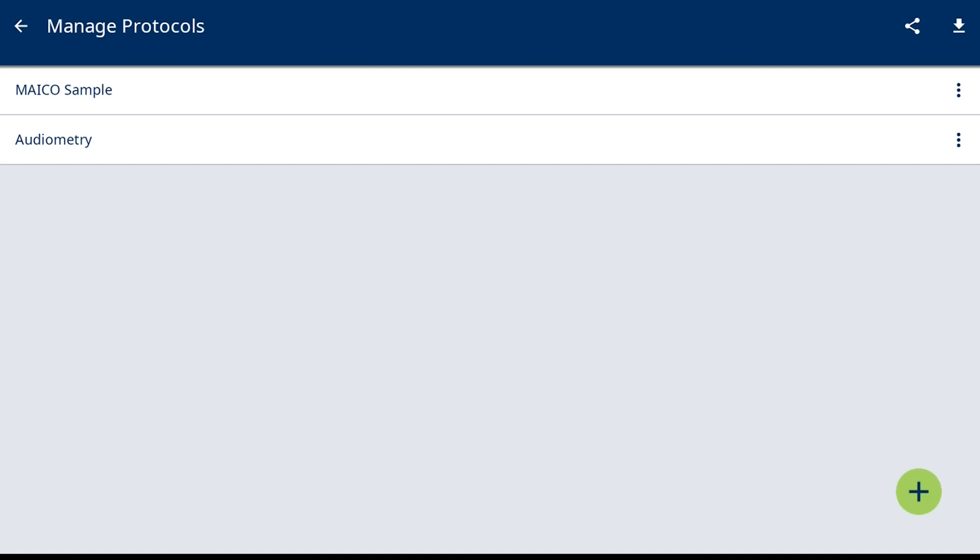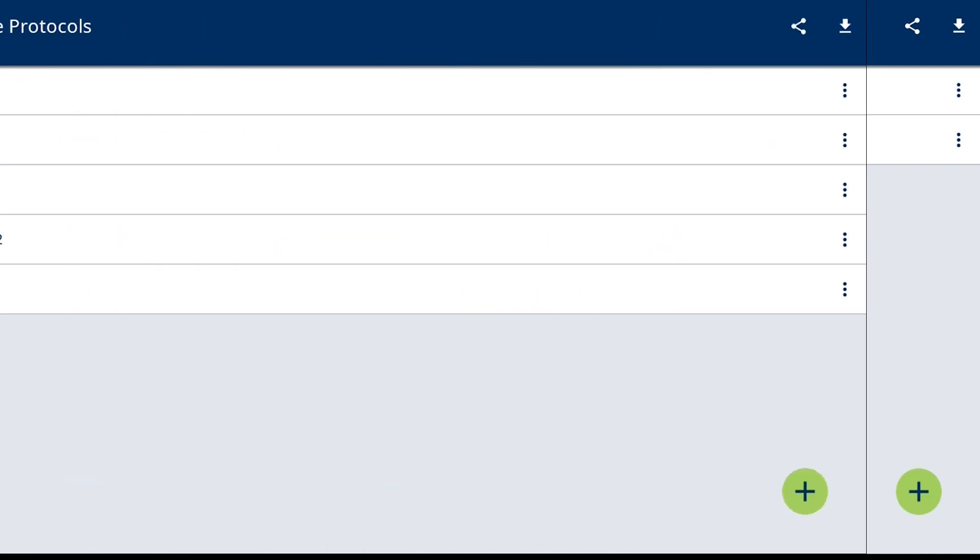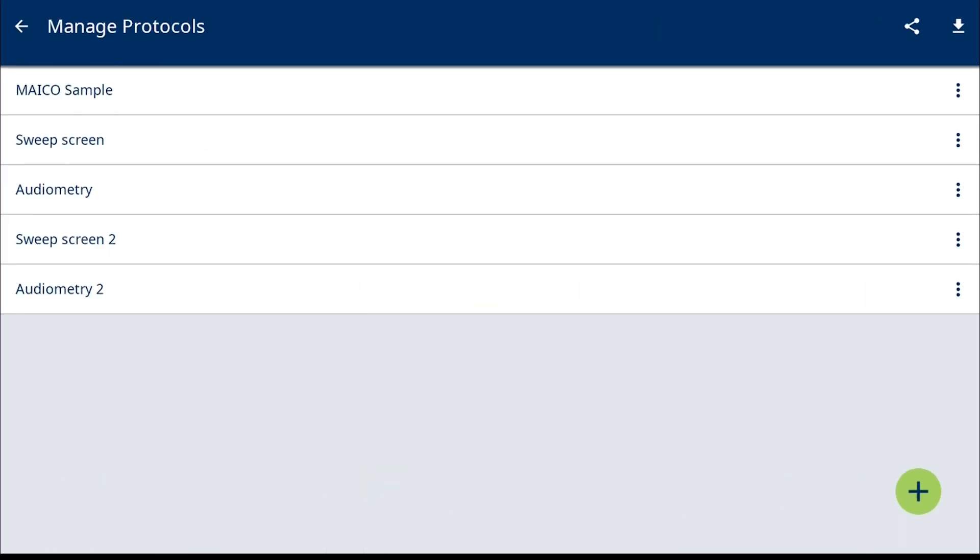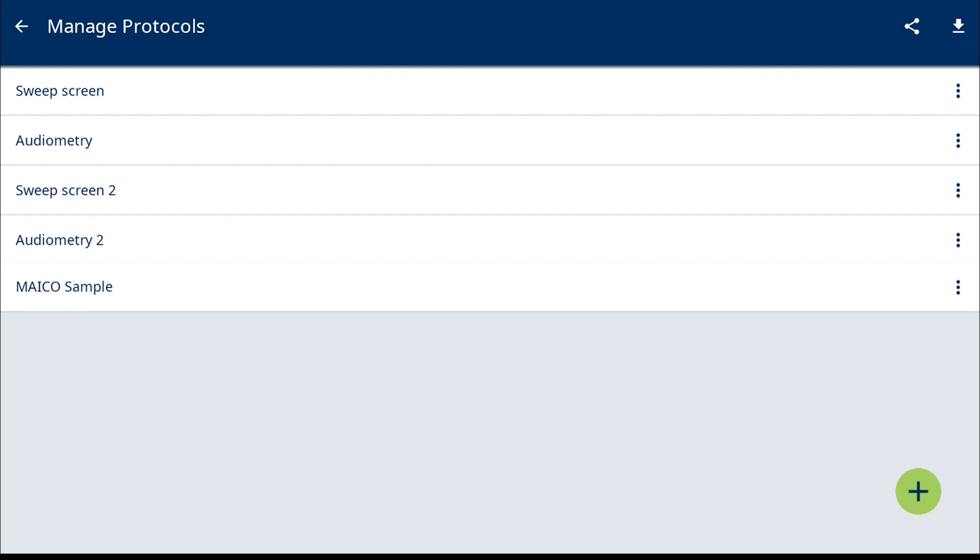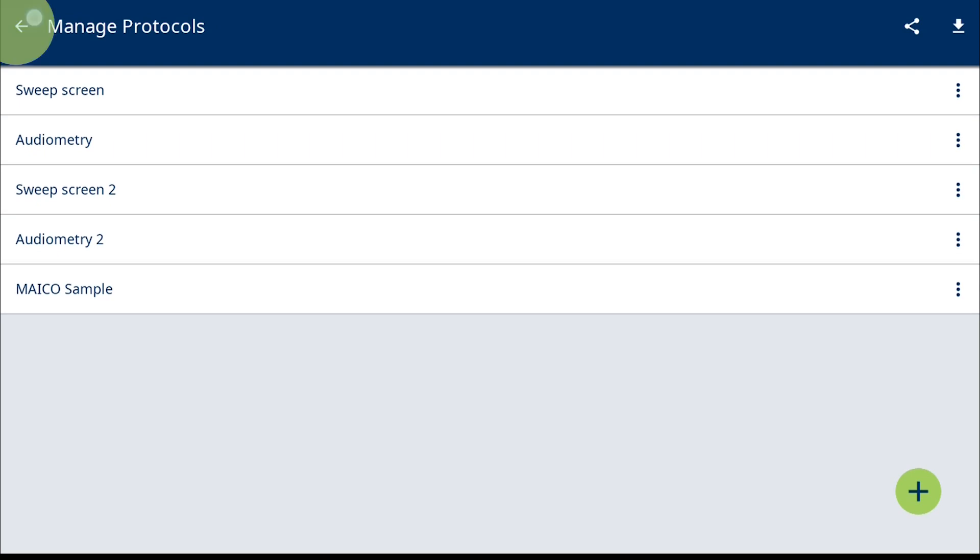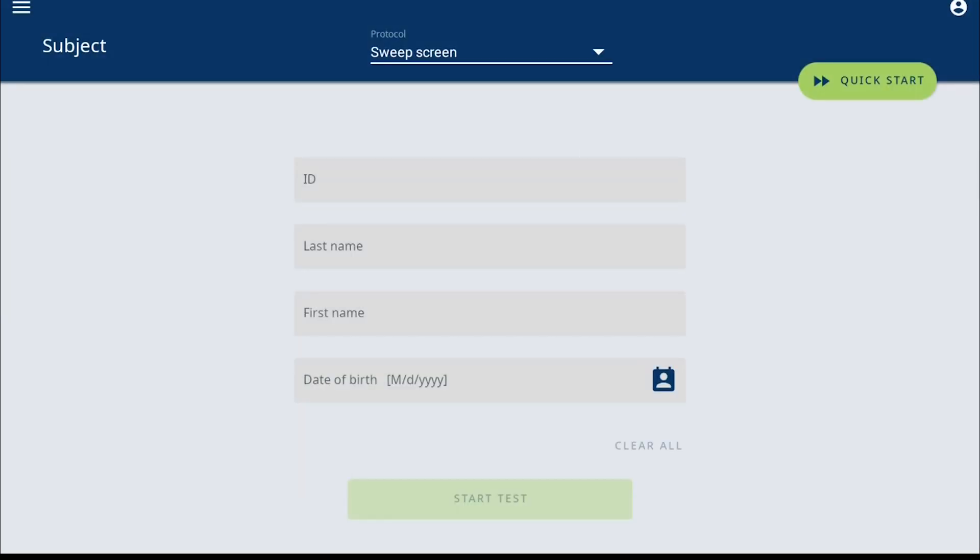When multiple protocols are created, to change the order of the protocol, simply hold and drag the protocol to the preferred placement. When done with protocol creation, select the back arrow to return to the Start screen.